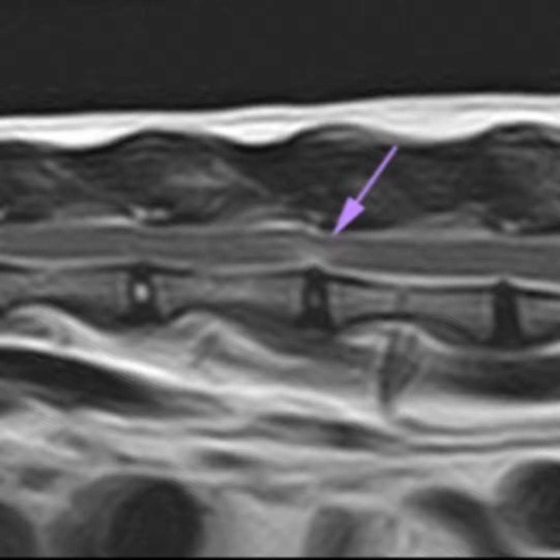We use the MRI criteria previously published in Frontiers, for example, in 2020, the review about intervertebral disc herniation. Yeah, I don't understand the question. I'm sorry. Yeah. Just for the listeners, could you expand on what it was that you looked for, what that criteria suggests for the acute non-compressive nucleus pulposus? What made you say this is acute non-compressive nucleus pulposus versus fibrocartilaginous embolism?